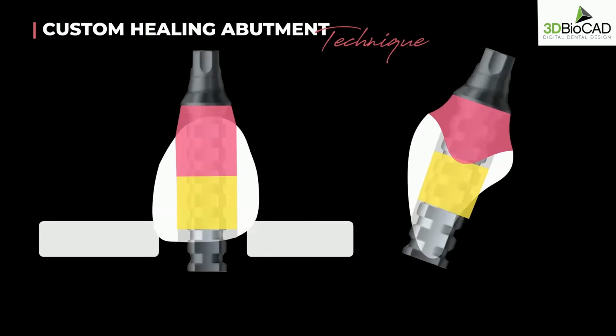That's one option. Another option is to use tooth-colored flowable composite. However, if you are planning on using a tooth-colored flowable composite, what I recommend is using a shade that's different from the shell temporary. Let's say your shell temporary was a shade A3, then I would use a shade A1 flowable composite to fill in the emergence profile region.